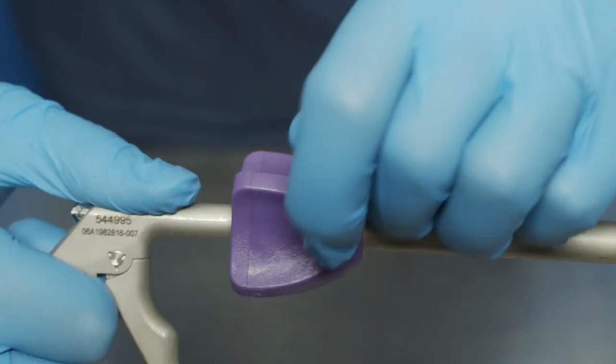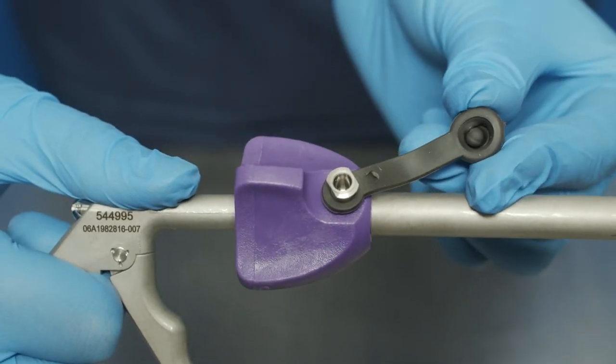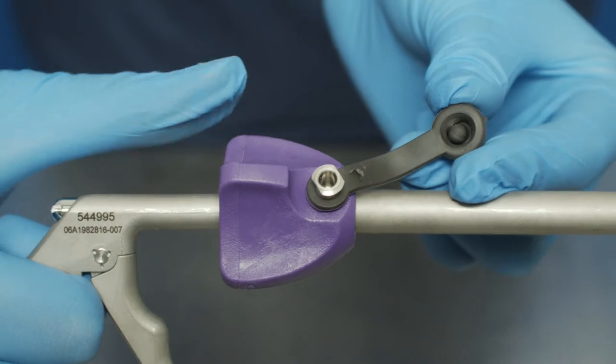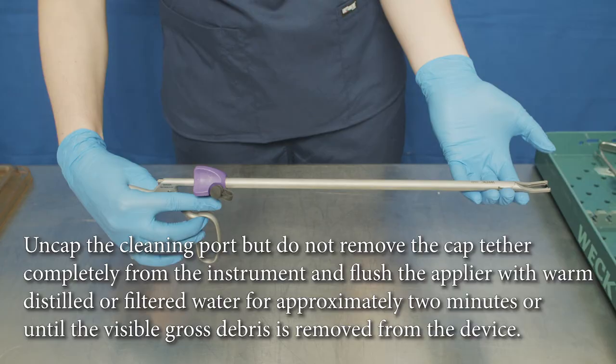Some of the endoscopic appliers are provided with a cleaning port, which permits access to the interior channels and cavities. Uncap the cleaning port, but do not remove the cap tether completely from the instrument and flush the applier with warm distilled or filtered water for approximately two minutes or until the visible gross debris is removed from the device.